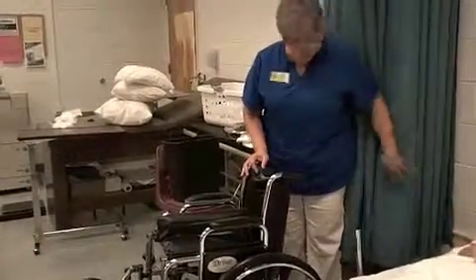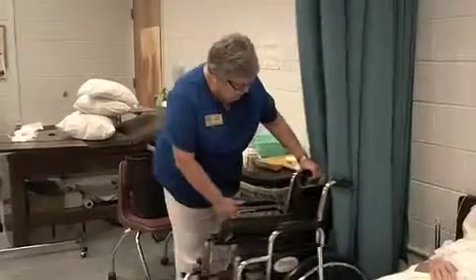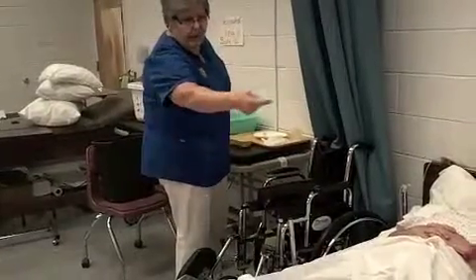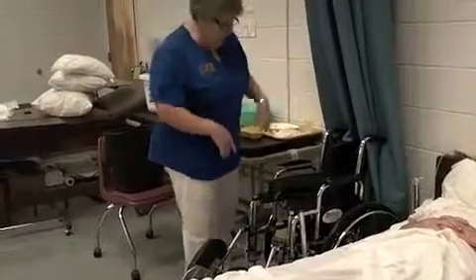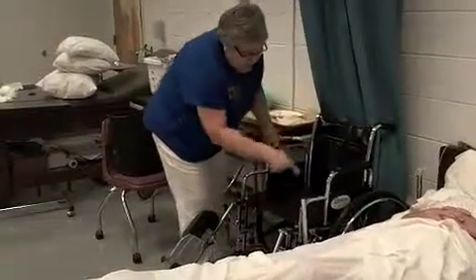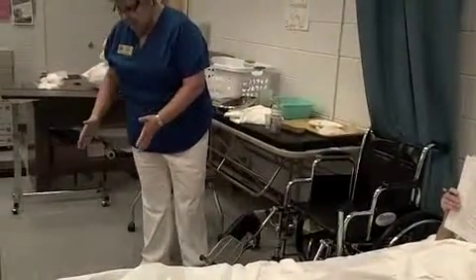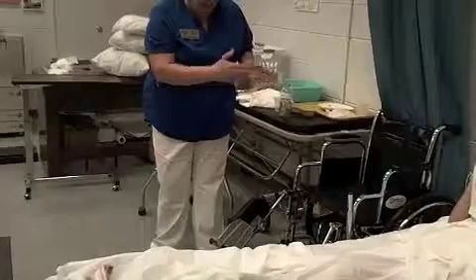If you have to move a chair or something, tell them to do it — it's their test, do it. Clear it out so they can get that chair where they want it. Now I could put it there facing that way and it wouldn't be in the way. Alongside — circle that word — the bed. Alongside the bed means next to the bed. It doesn't mean sit it out here and take two or three steps to get to it. They shouldn't have to step to get to it. They should have to stand, pivot, sit.